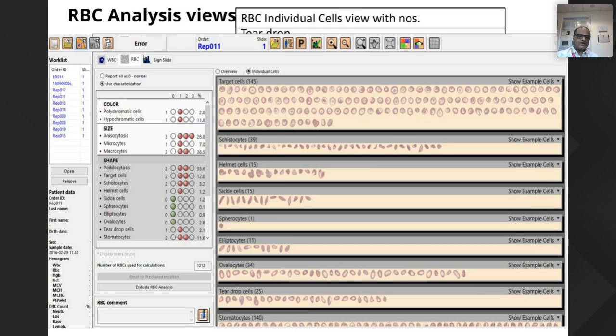Now, when will this be helpful to us? There is a guideline, which you can go through if you don't know it. It's called the peripheral review grading of the RBCs. It says what the percentage of cells should be to classify into hereditary ovalocytosis, and how much percentage of cells you want for fragmented RBCs to diagnose a case itself.